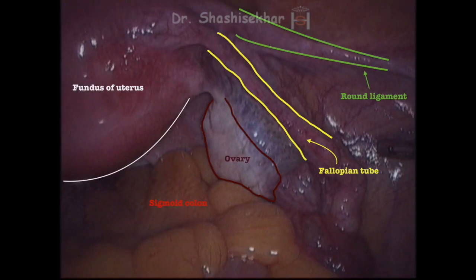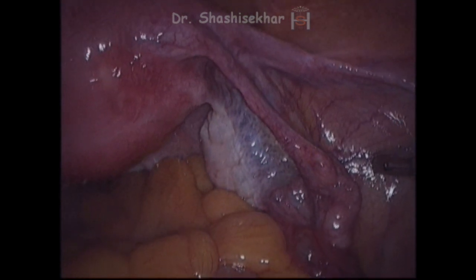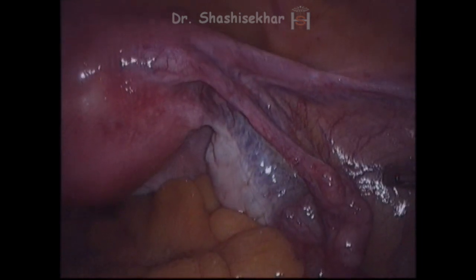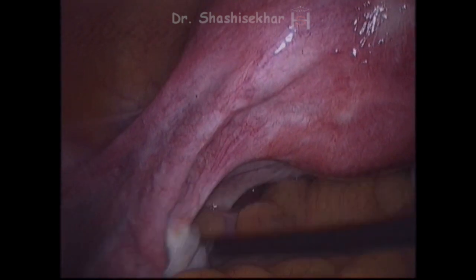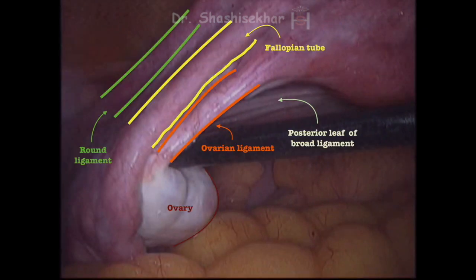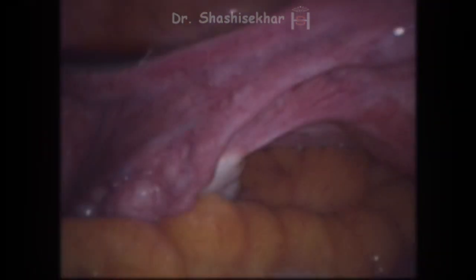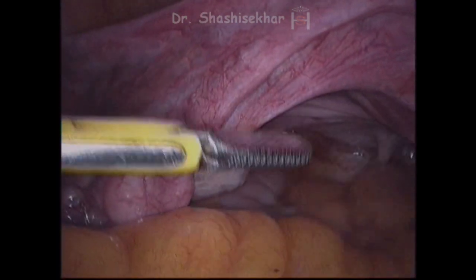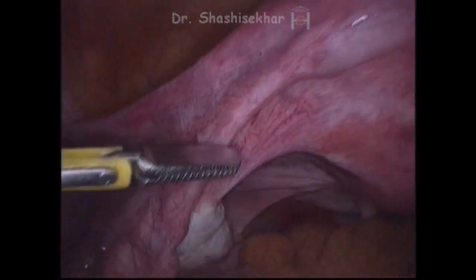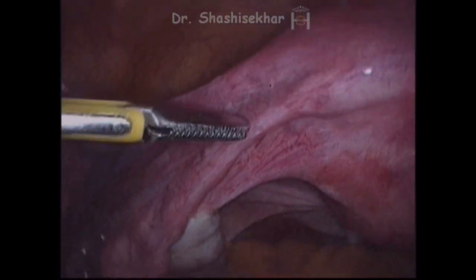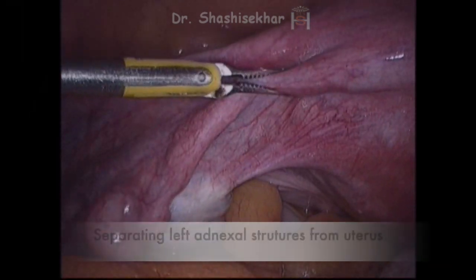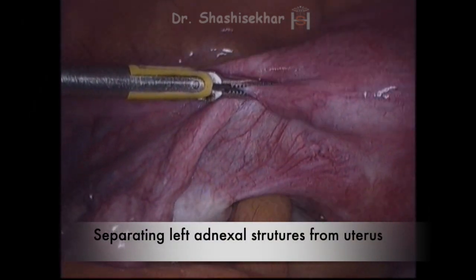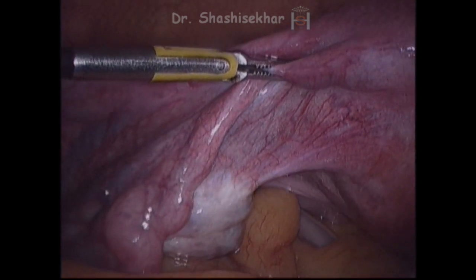As you can see, all the structures are labelled on the right side — these are essentially the ones you need to remove to mobilise the uterus. These are the structures on the left side: the round ligament, the ovarian ligament, the fallopian tube, the ovary, and the posterior leaf of the broad ligament. Before going for hysterectomy, we are inspecting the pouch of Douglas — that is the rectum you see. There is a minimal amount of serous fluid in the pouch of Douglas.